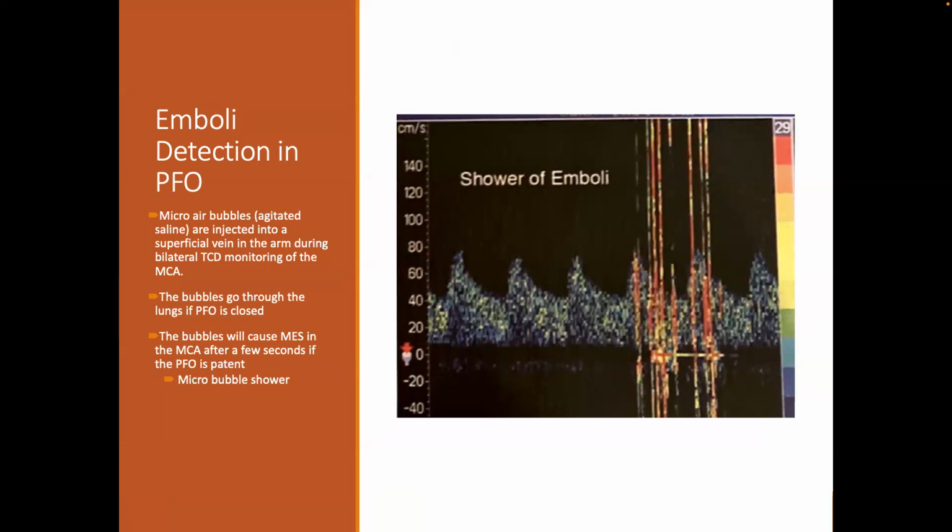So this is basically just showing you again, the microbubbles showing up as a shower in the spectral display.